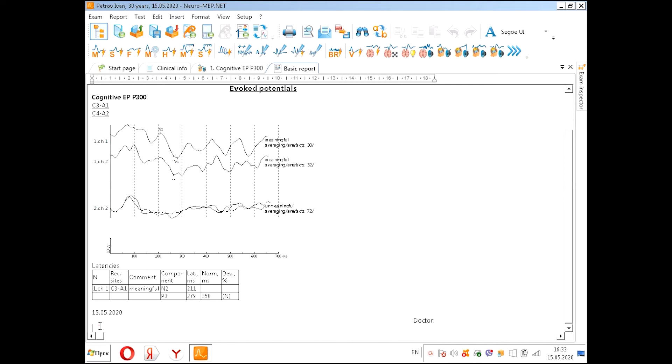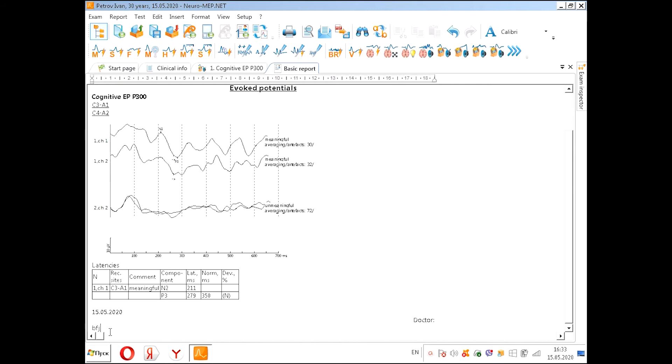Now we can print here something, print and put the doctor's signature. Thank you.